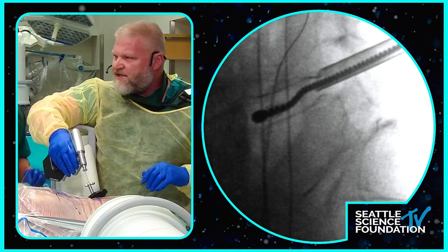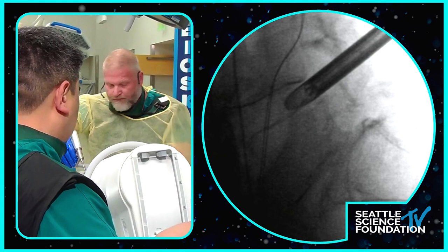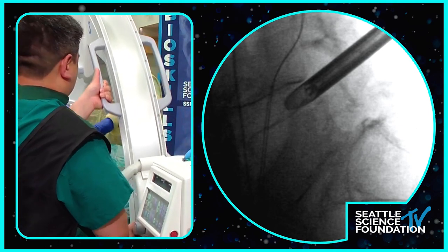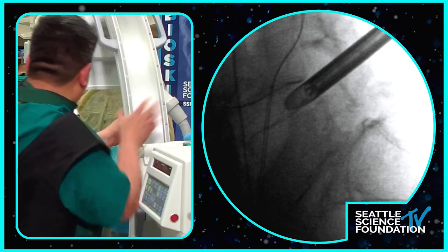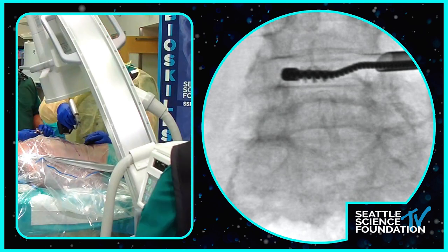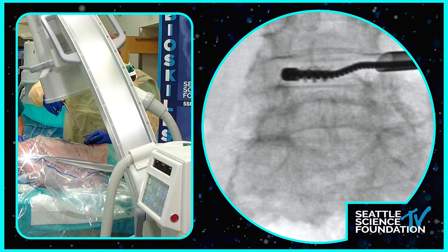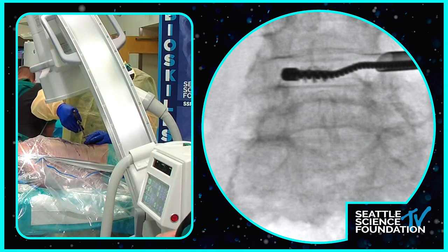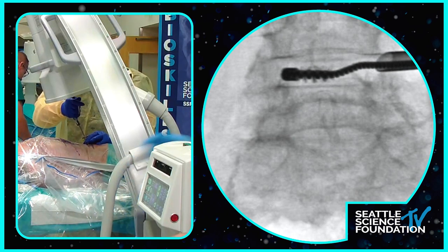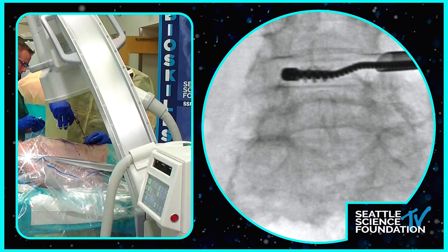Give me an AP real quick. So I want to see how I am across the disc space. So you see I'm towards the front portion of the disc. I want to be towards the medial wall of my contralateral pedicle. I'm going to use this instead of the auger because it should be a little bit faster. And then we'll put the bag in and then we'll fill it. Yeah, so you see how that's going across medial wall of pedicle to medial wall of pedicle? Yeah, we'll do a couple scrapes. There we go.